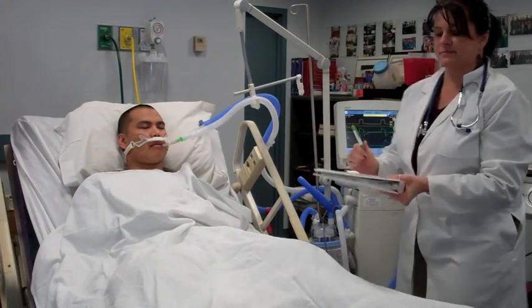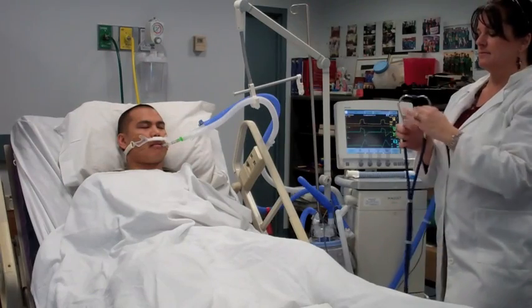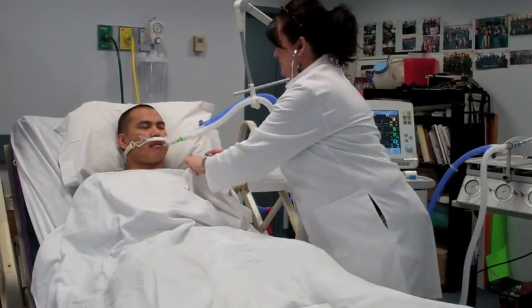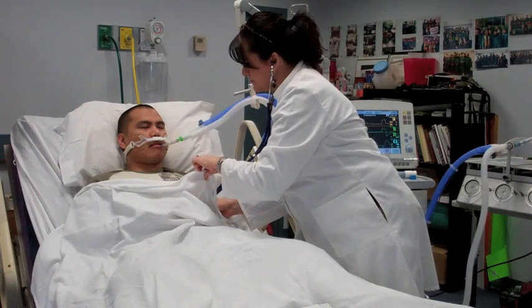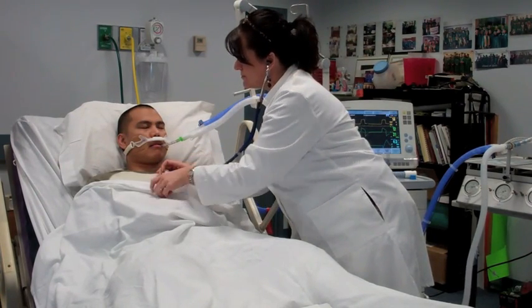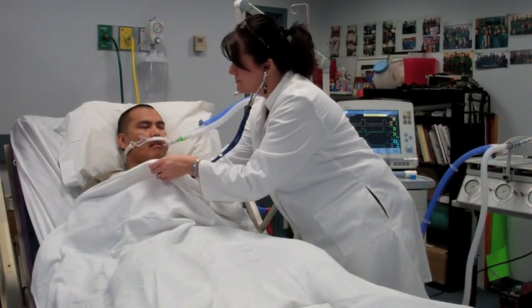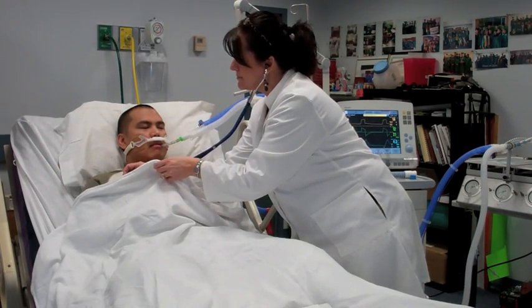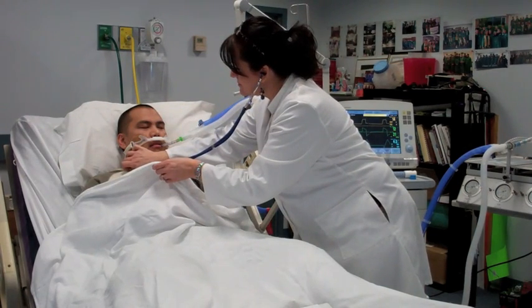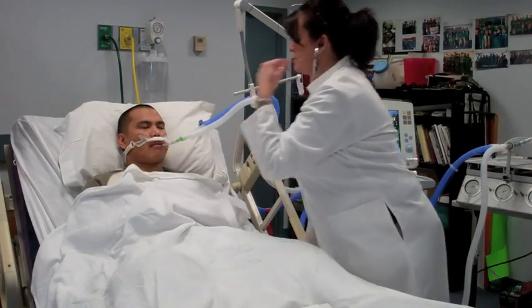After two spontaneous breaths are triggered on the ventilator, Auto Mode delivers supported breaths based on the patient's efforts, instead of a controlled pre-programmed pattern such as PRVC. Should the patient become apneic for a set number of seconds, the ventilator will automatically revert back to the control settings. Typically the apnea time is set at 12 seconds for adults and even less for pediatrics and neonates. While in Auto Mode, the patient is either receiving all mandatory breaths or all assisted breaths.